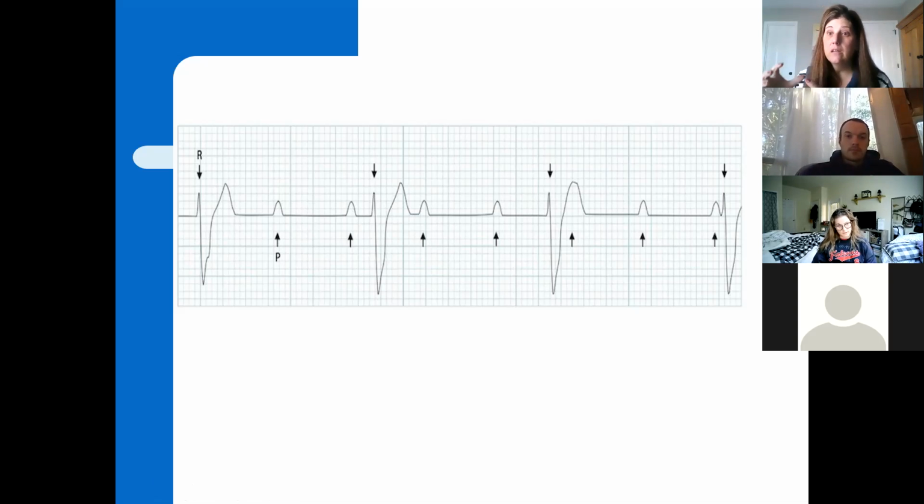Again, you have to understand and be able to identify and know what your normal measurements are so you know what normal sinus rhythm is. Then learn all the rest of your sinuses, sinus brady, sinus tach. Learn your sinus arrest and your sinus exit, and then move into your bucket of atrials. Premature atrial contractions, atrial fibrillation, atrial flutter, move on into your blocks. 1st degree, 2nd degree, type 1 and type 2, and 3rd degree.